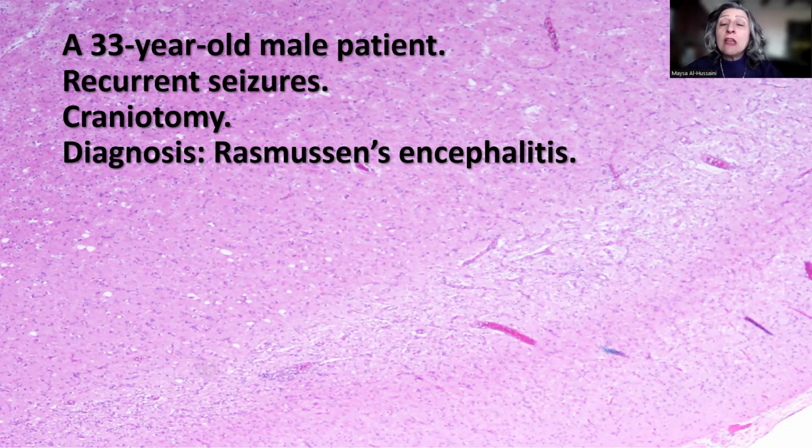Remember that this is a completely inflammatory process in which the rod cells, which are activated microglial cells, become very prominent, with CD68 positivity highlighting them. CD3 positive lymphocytes outnumber the CD20 lymphocytes around the blood vessels. This is extremely important, and we also encounter some gliosis because of loss of ganglion cells in some areas where really the focus would be mostly, at least in this biopsy, in the temporal lobe, but usually Rasmussen's would really affect almost one hemisphere.